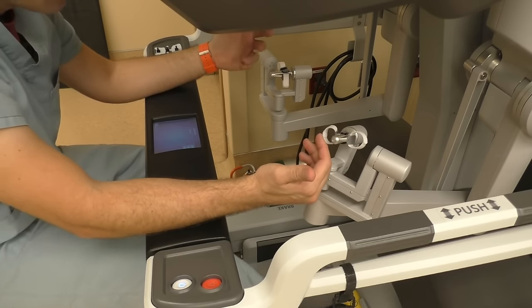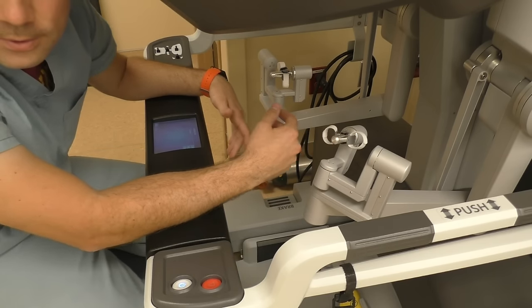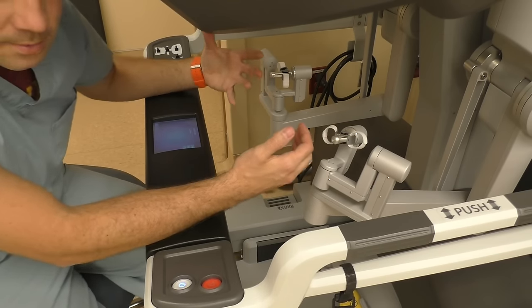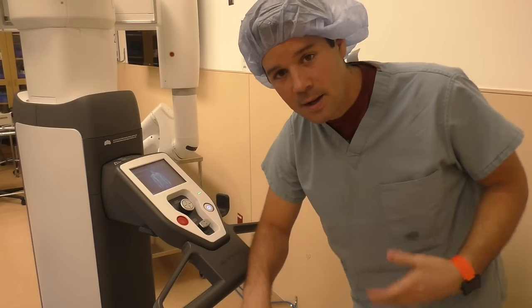With foot pedals down on the ground — bipolar, monopolar, and movement of the camera pedals — all down on the ground as well. So everything that the surgeon needs to operate at the console is all right here.